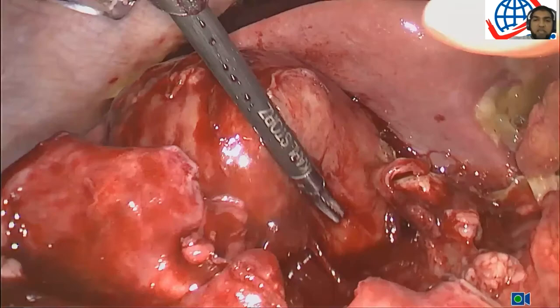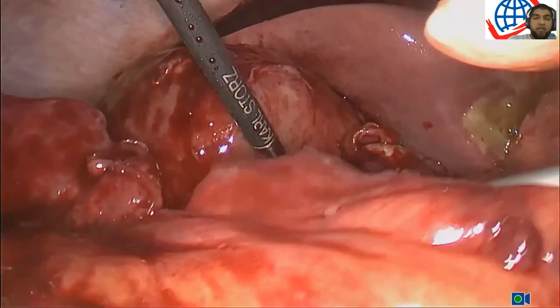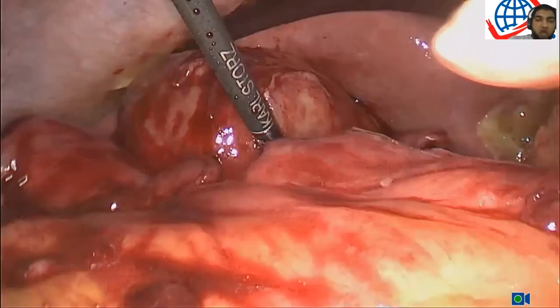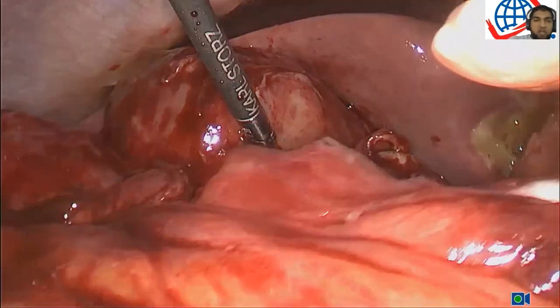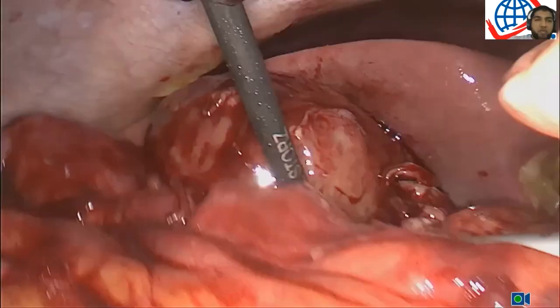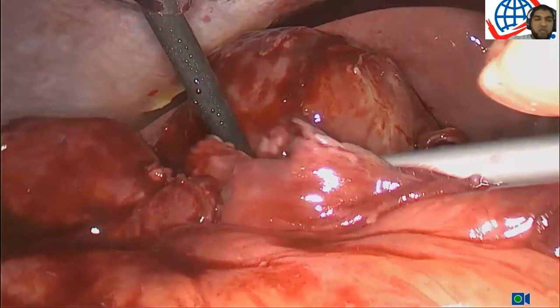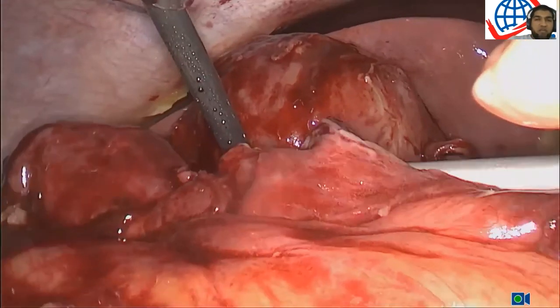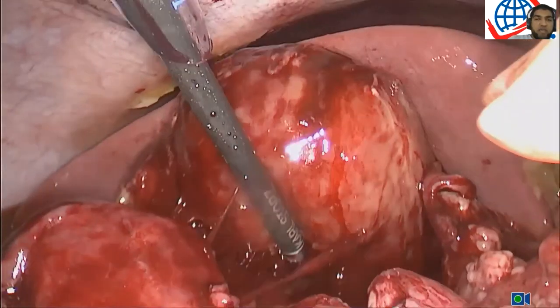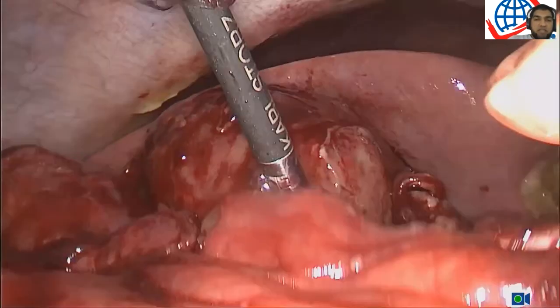So as you can see from the commencement of the operation, it was difficult to visualize the gallbladder. The first thing that we did was to try and find the top of the gallbladder. Once the top of the gallbladder was free, then we started to work around the gallbladder. So we started on the sides, we started on the anterior aspect between the gallbladder and the omentum, and on the lateral aspects. And if you progressively continue with that, as you can see, slowly we are now mobilizing the gallbladder and it is starting to come free.